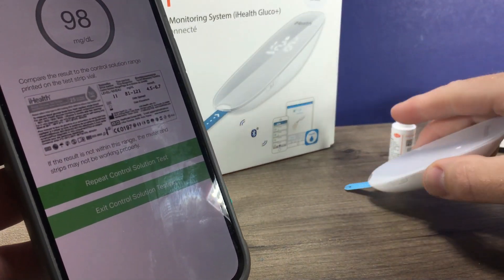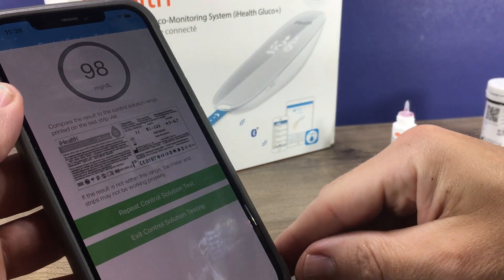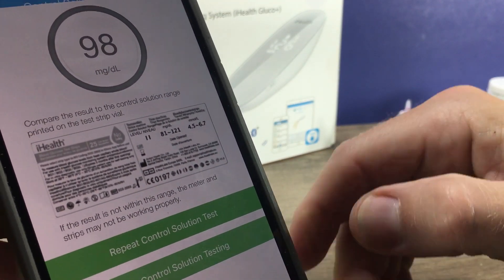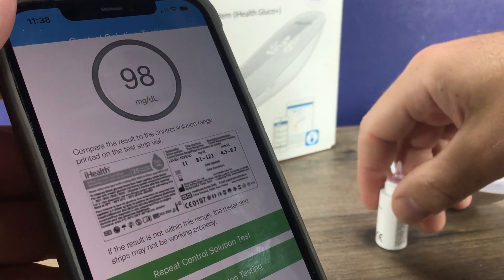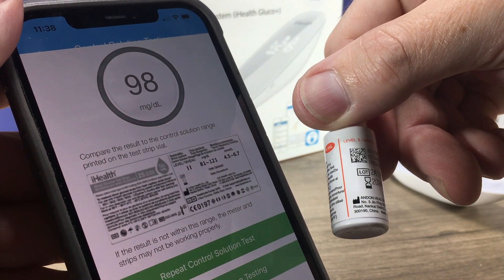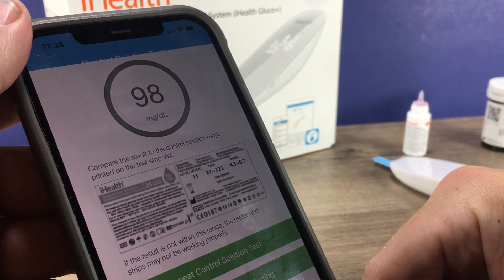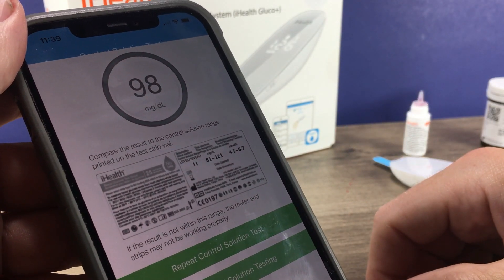And then what it shows us here is 98. Now that has nothing to do with your blood sugar reading — that is just the control solution. And if you can see there, it says control solution level 2, which is the one that we have. Level 2 should be in between 81 and 121. So that is telling us our meter is reading correctly — it is within that range. It just helps ensure that that is an accurate reading.